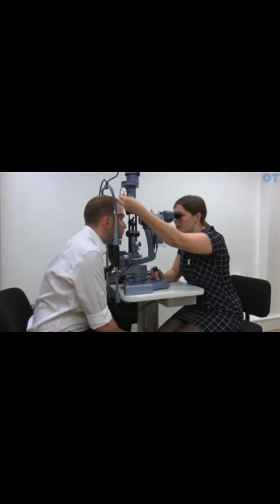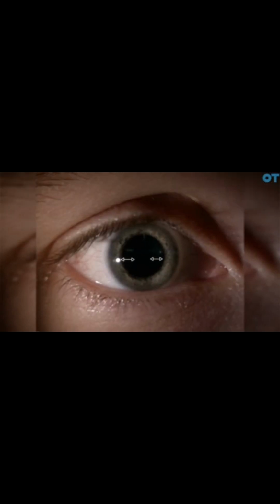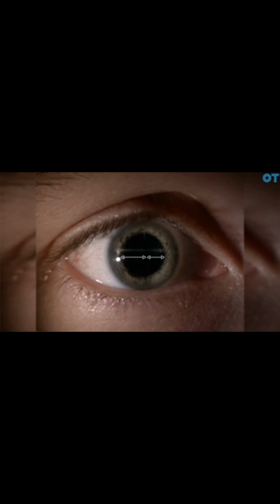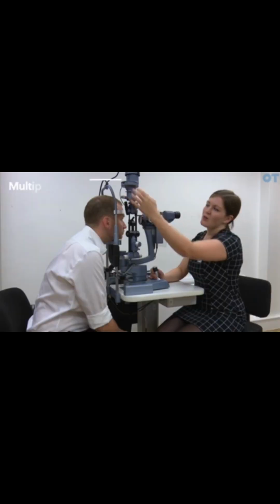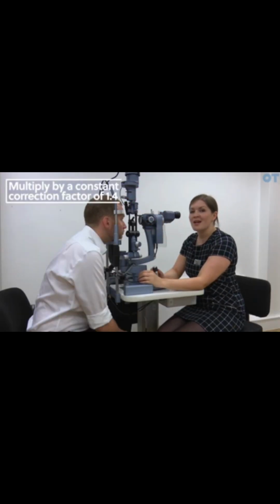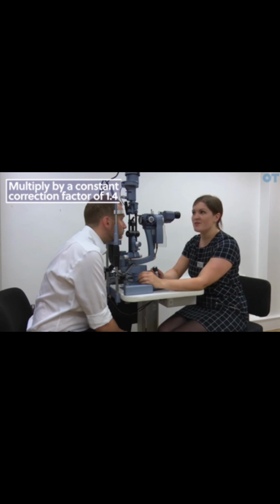What you're doing is using the slit height, so you're gradually increasing the slit height until the two beams just appear to touch. At that point, you then take a reading from the graticule and you multiply the reading from the graticule by a constant correction factor of 1.4. And that will give you a quantitative measure of the anterior chamber depth.